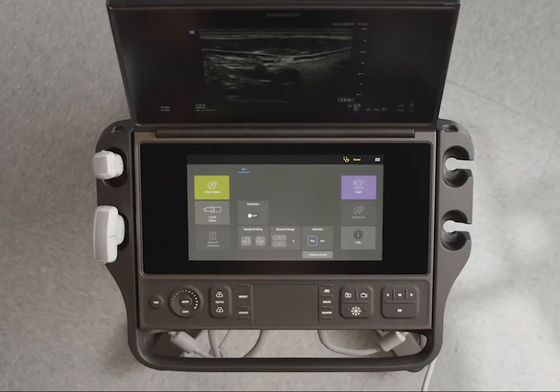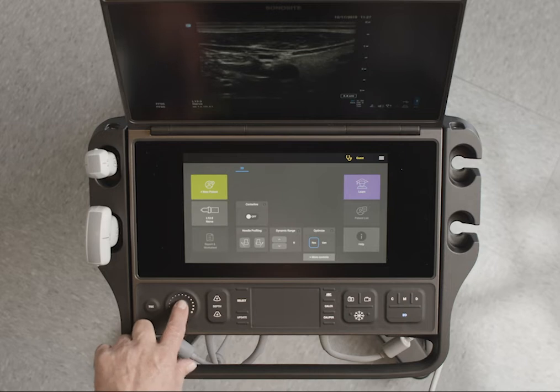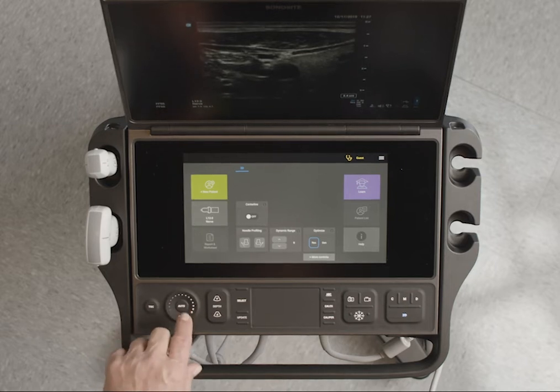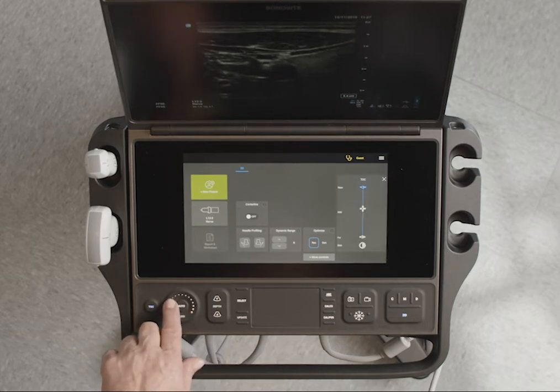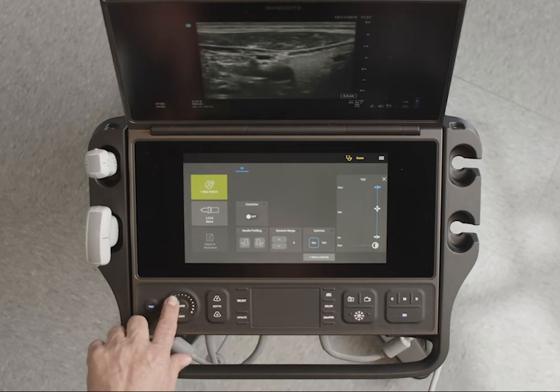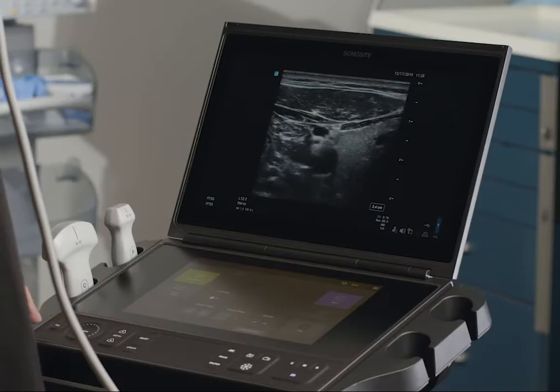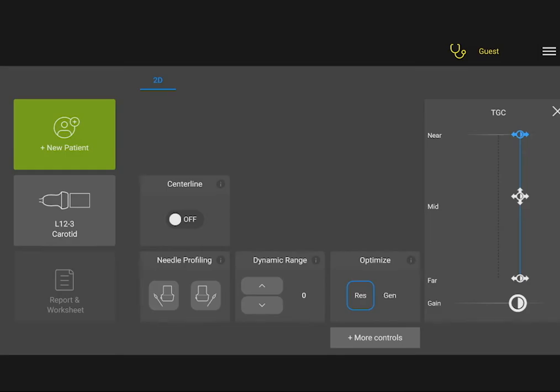You can adjust the gain on your system in several ways. Use Auto Gain to automatically adjust the image. Use the Gain Wheel. Use the TGC Control and the Touch Panel to adjust the on-screen gain controls for fine control of the gain profile.